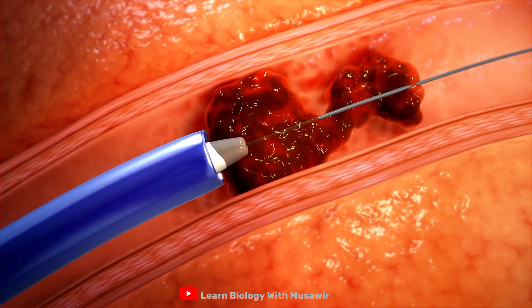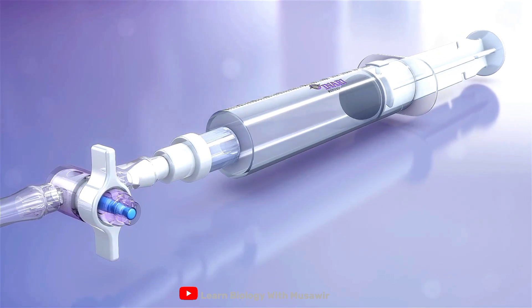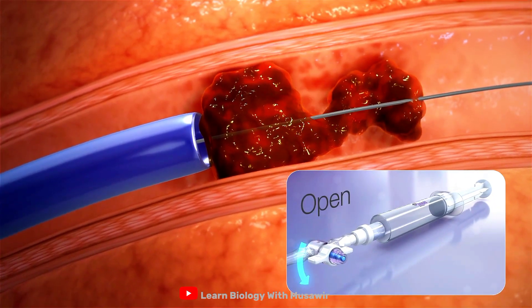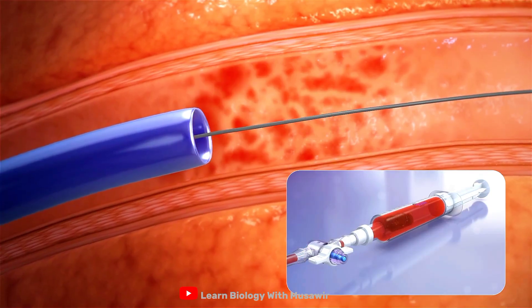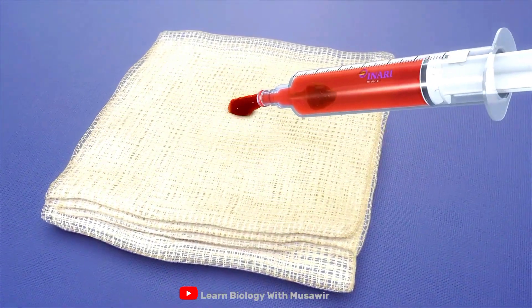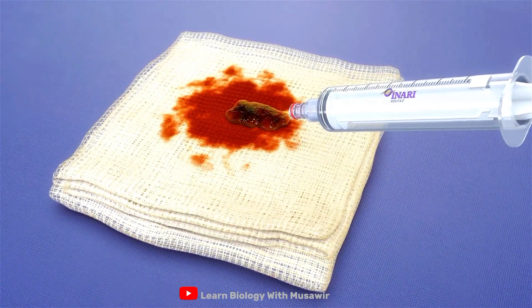The dilator is removed and with the flush port stopcock closed, the syringe is pulled back and locked into place. Opening the stopcock releases the vacuum and creates a high-flow, volume-capped aspiration, minimizing blood loss while drawing clot through a continuous lumen into the syringe.